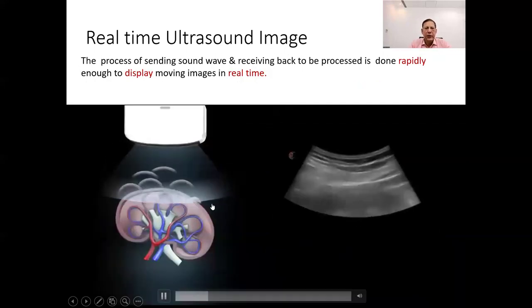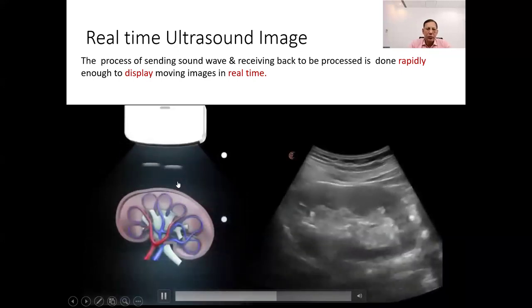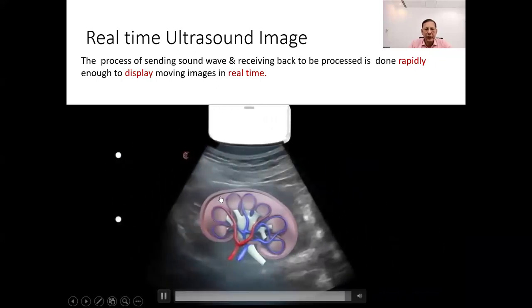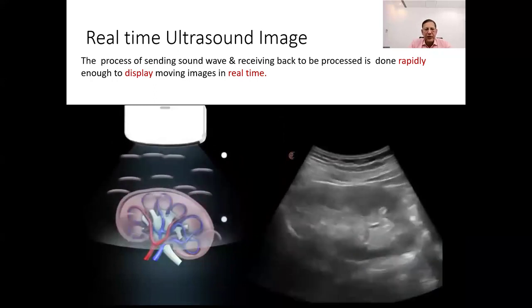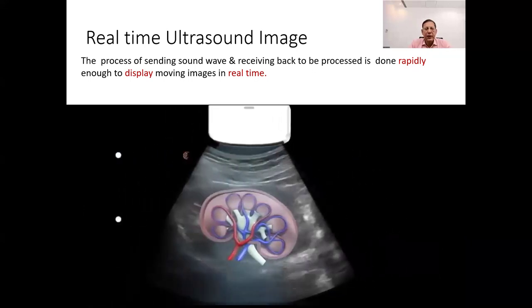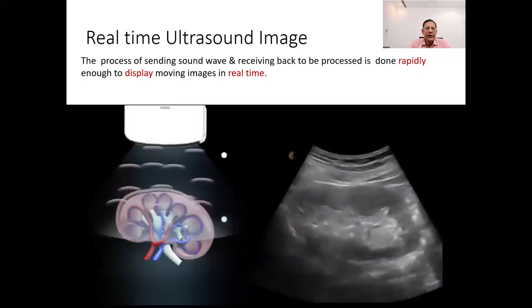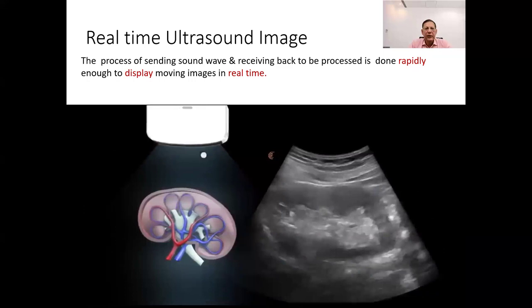So what is real-time scanning? In real-time ultrasound imaging, scan lines are rapidly generated and displayed on the ultrasound monitor. This results in a dynamic and continuous image of the internal structures. Each scan line contributes to the formation of the final image. The combined information from all scan lines provides a comprehensive visualization of the scanned area.